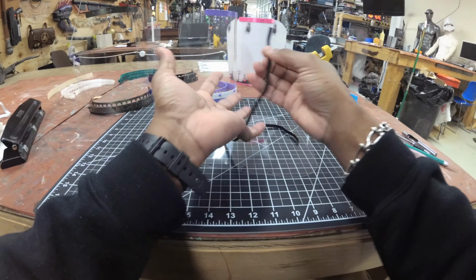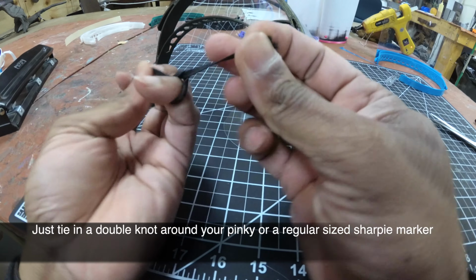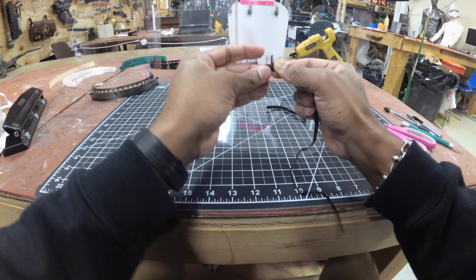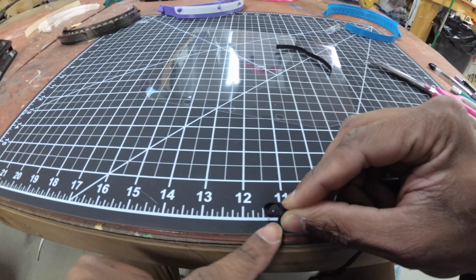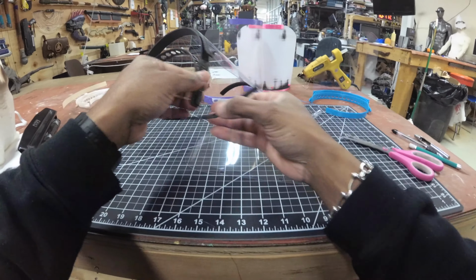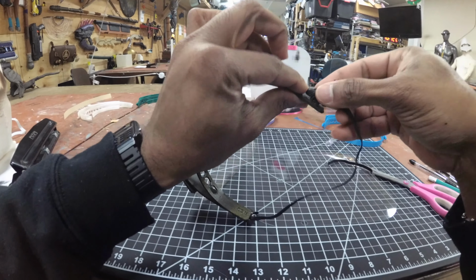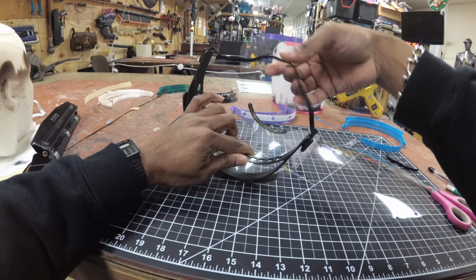Okay. Once you have that cut out, you're going to grab your pinky and go under, almost like I'm tying a shoelace, right? So, and just knot that right there. Okay. So you should end up with a little hole. It's about a half inch wide. So you're just going to go ahead and slide that in and pull back. And it should be taut and tight and then in place. So I'm going to do the same thing for the other side. Slide on one end to the other. And now we should have an elastic that's fitted to our dimensions.